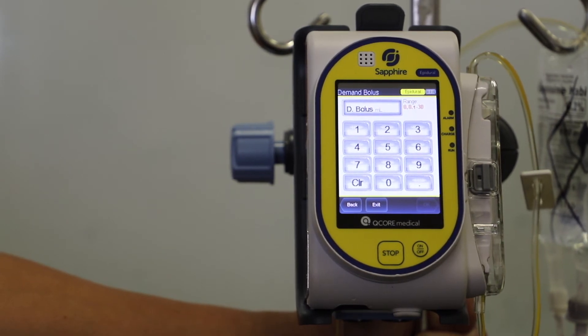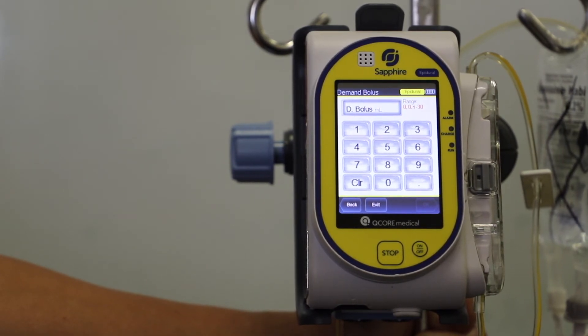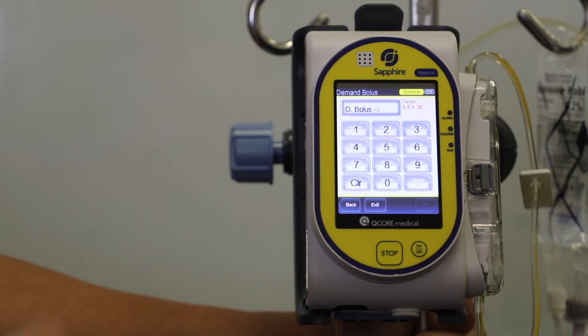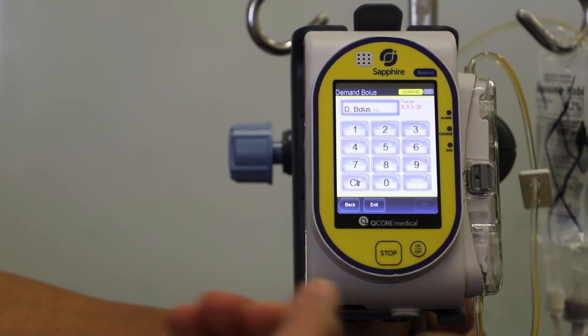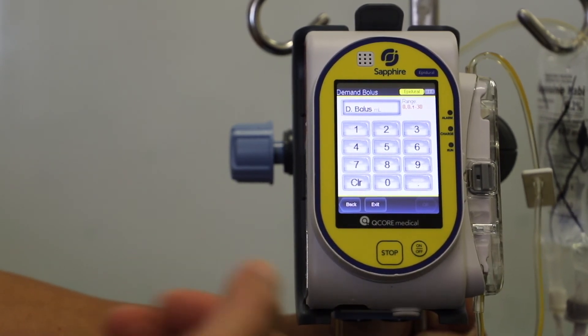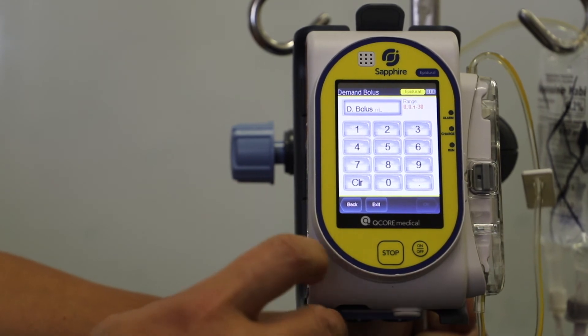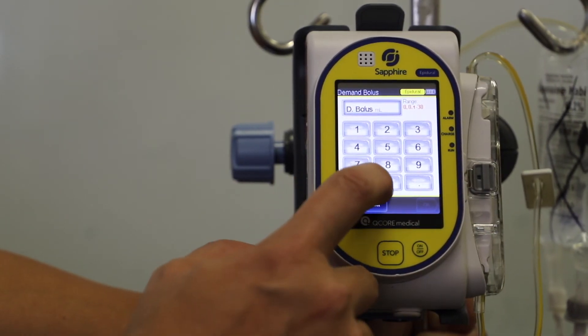D bolus stands for demand bolus. So if it's continual rate, there's no demand. The demand bolus refers to as if it was a PCEA, where it has a handset where a patient could press. So we select zero.